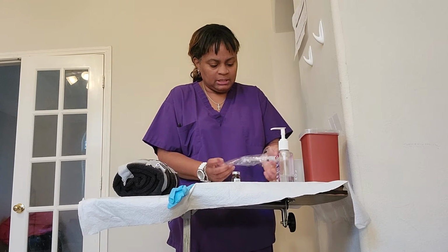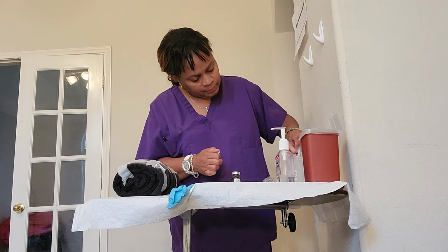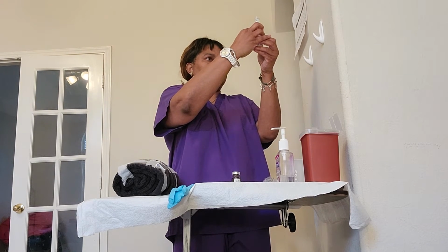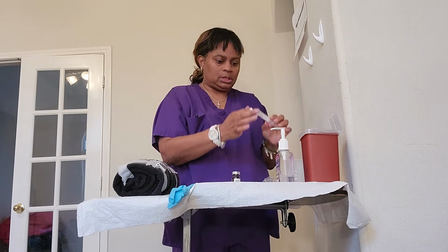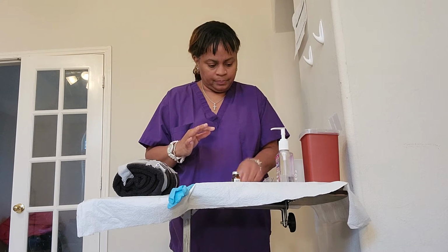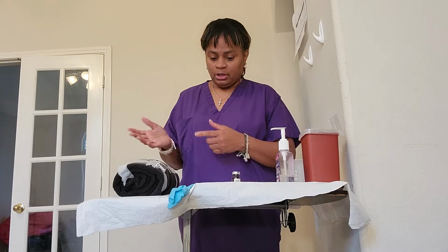Doing the same with my second vial. I'll be wasting 7 mLs. Ensure there are no bubbles in my syringes. Okay, there are no bubbles, and the next thing I'll do is my hand hygiene and go on to the patient.